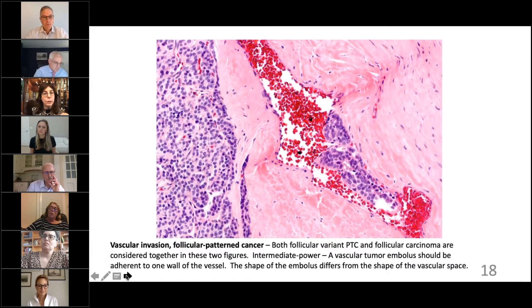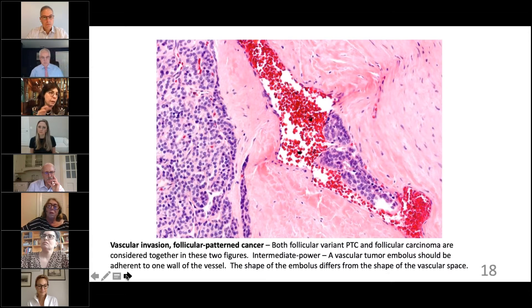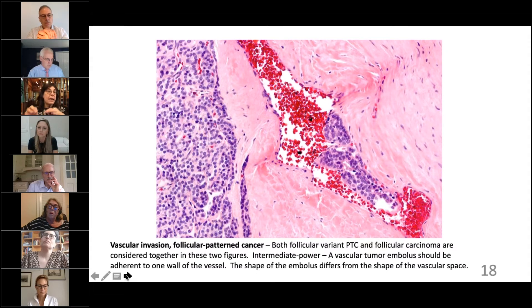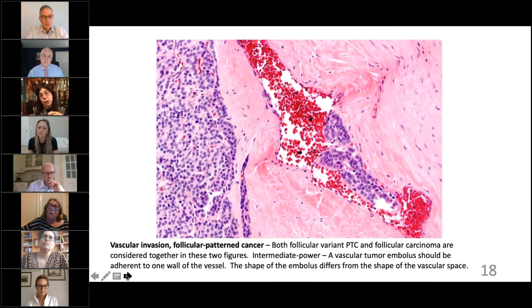You don't have to look at the nuclei here — the nuclei don't tell you whether it's PTC or follicular carcinoma. In fact, this might be from a PTC, which often has nuclei that look like follicular carcinoma. But look at the large vascular channel. It's obviously vascular, not lymphatic, because of the RBCs.